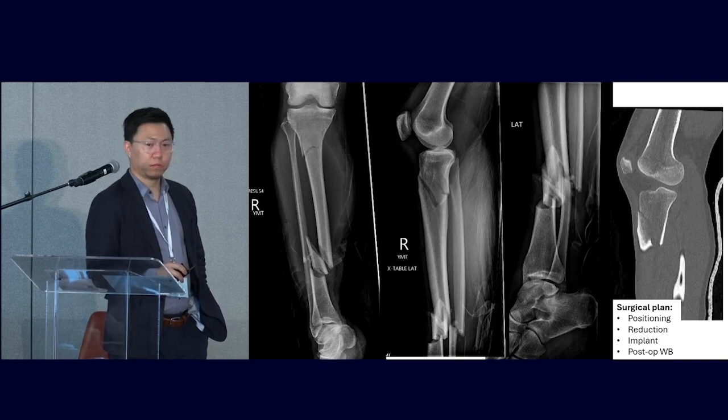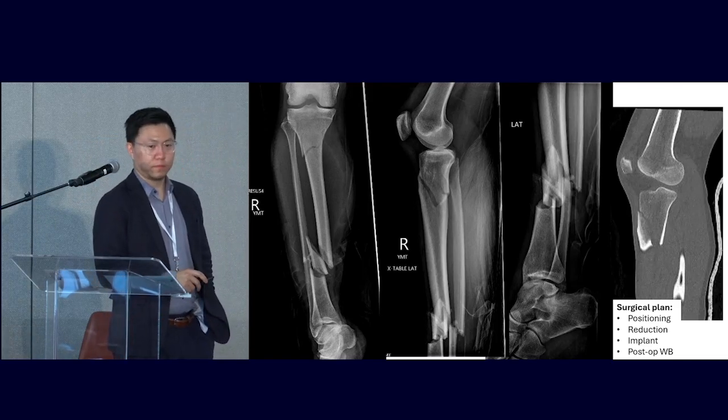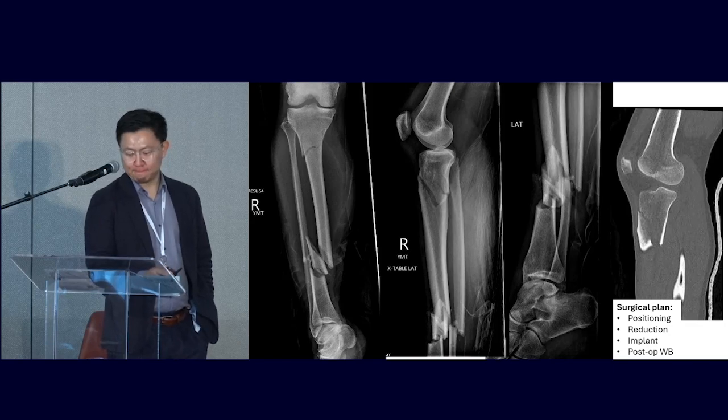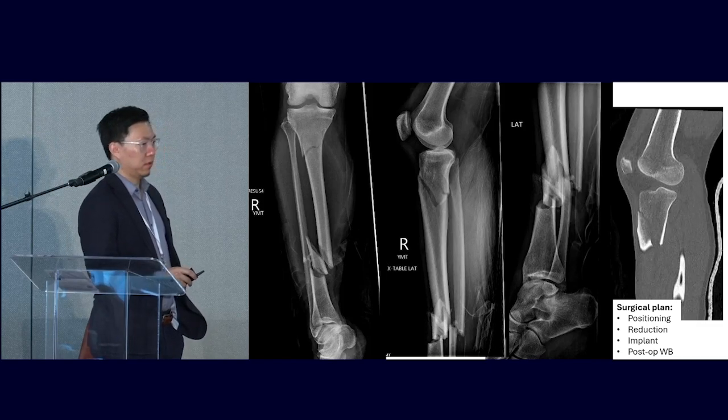But the question is, do you open it up from the medial side or the lateral side? I always go from the side that it's open and extend it as much as I can. You don't have to, there's no rule that says you have to go through the traumatic wound. If it's open bone, you don't have to make that hole bigger over the perioperative. That's your point, right? You can make it over muscle, do the same thing, and then if you have a defect when you're done, you just skin graft it. Andy, nobody gets infected in the snow, right?